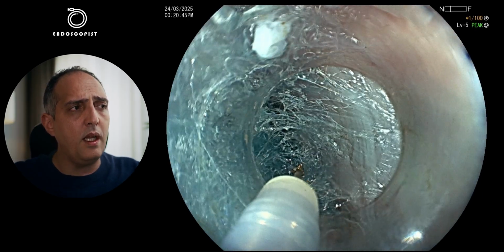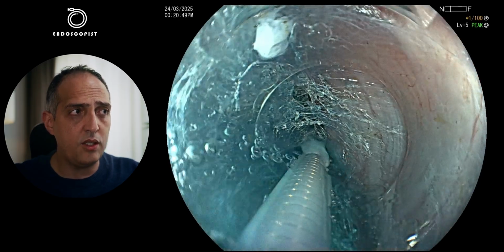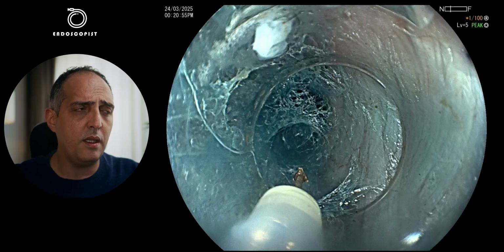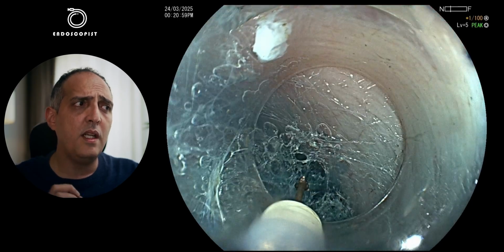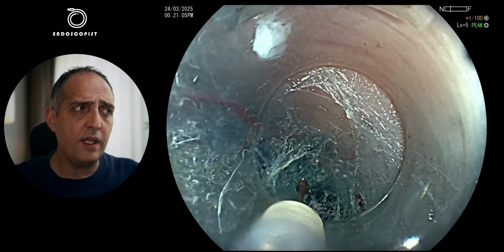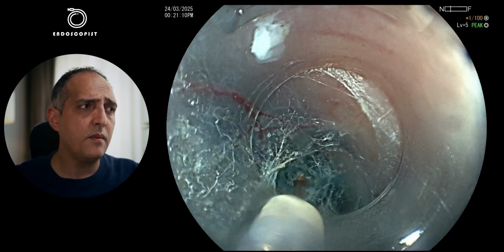And I always keep the tip of my knife under visualization near to the scope to minimize any trauma or any injury that can happen either to the mucosa or to any vessel. And as you can see here, I give spray coagulation, very short spikes. Again, with the traction of the cap, it will open very fast.